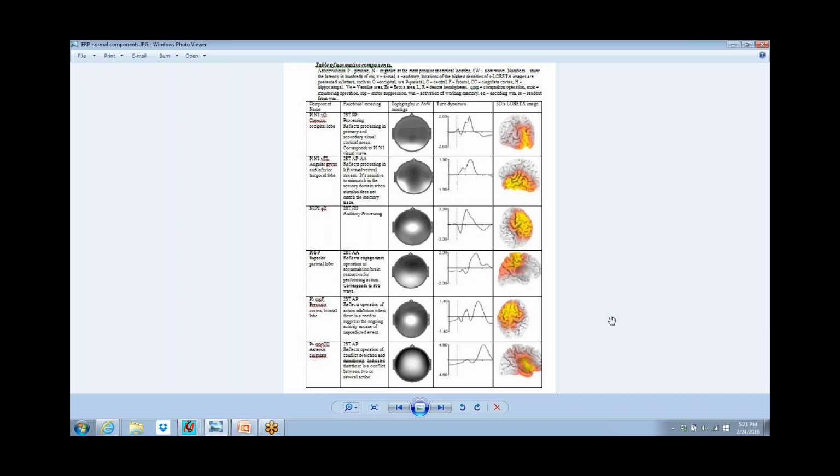Now, event-related potentials, on the other hand, are considered diagnostically specific. They will show you where in the brain the delay in the reception or the absence of the response actually is. So the ERP is considered diagnostically useful. In fact, it's diagnostically specific for TBI, showing the actual location of the damage and nature of the damage. You could obviously end up seeing whether there was a sensory detection or processing or motor engagement, exactly what step was off and where, very nicely.